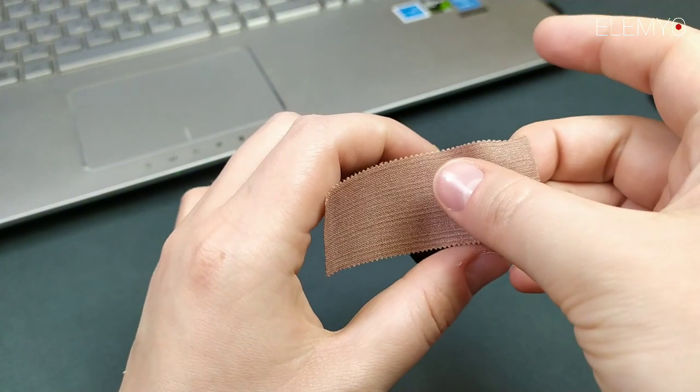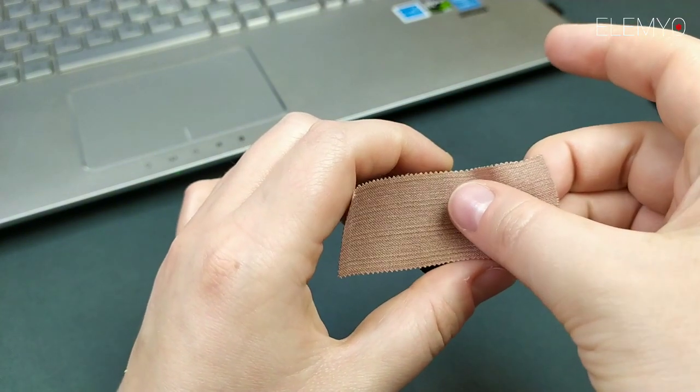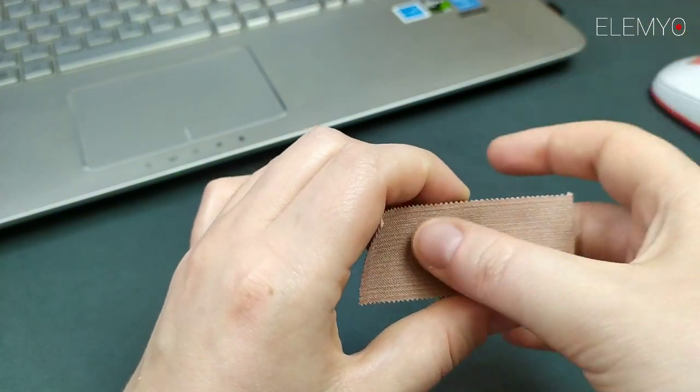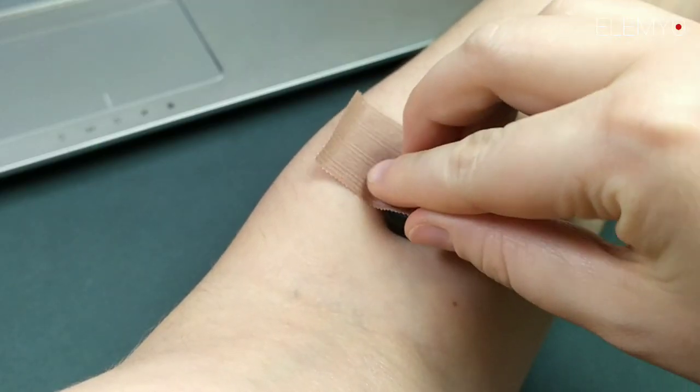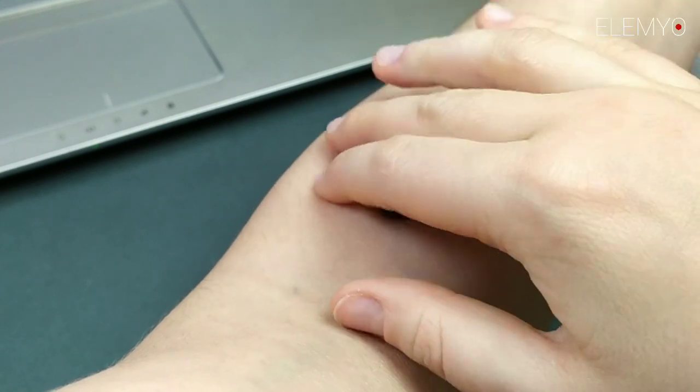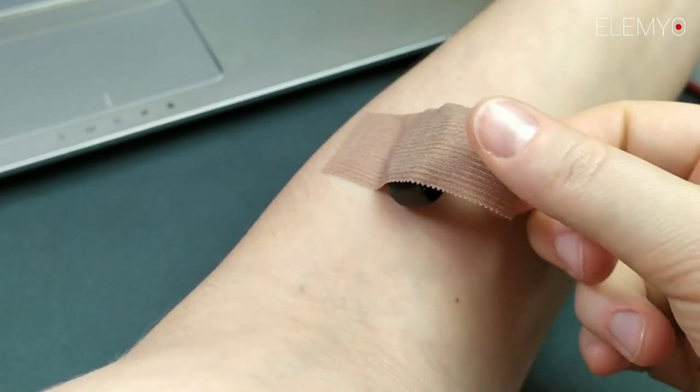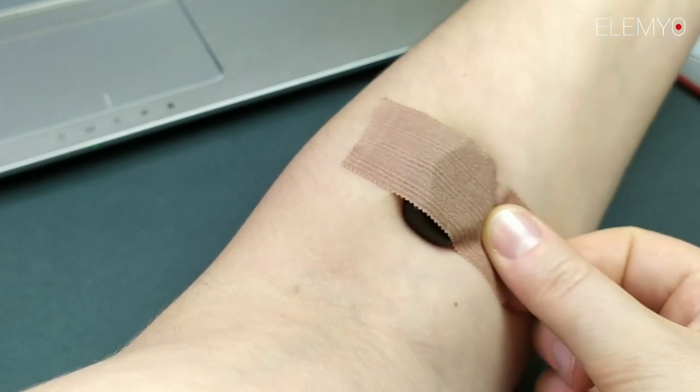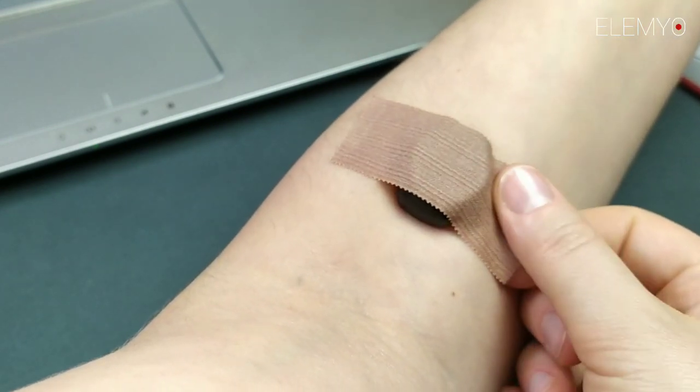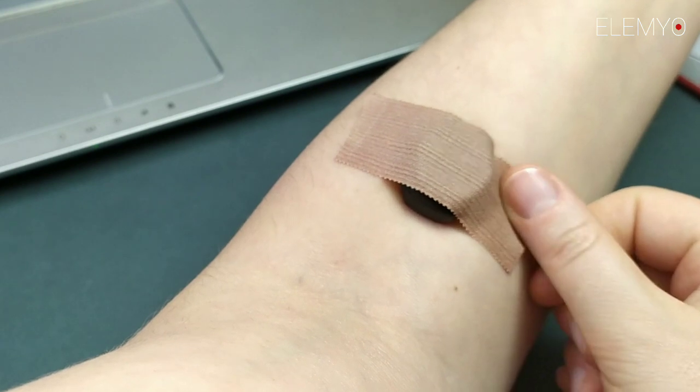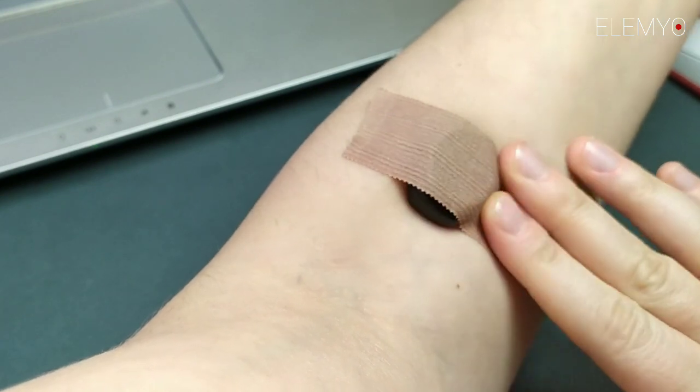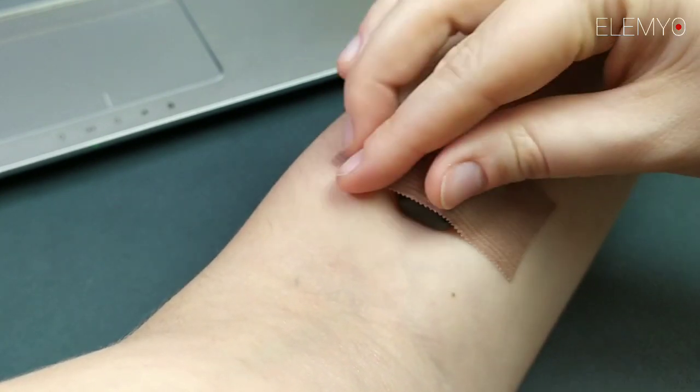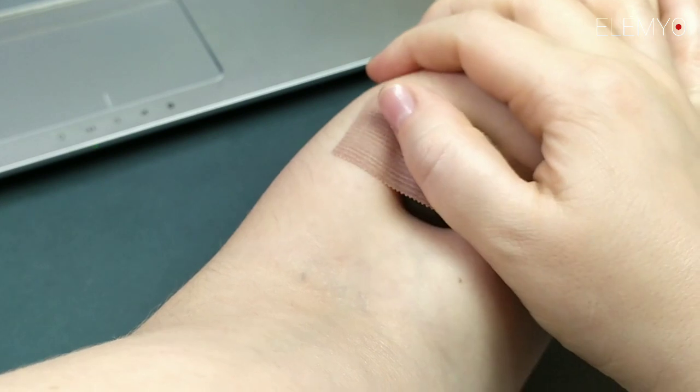Firstly, attach the cut piece to the sensor and then place the sensor on a target muscle. We recommend to stick one end of the tape to skin, then tighten the loose end and stick it in a slightly taut condition. This method will provide good contact between sensor and skin.